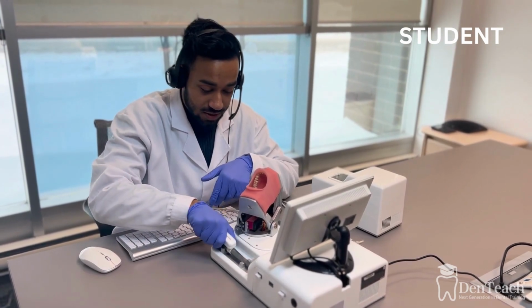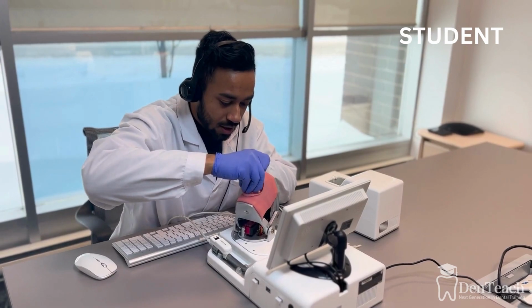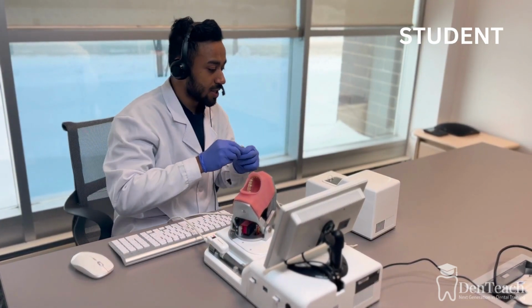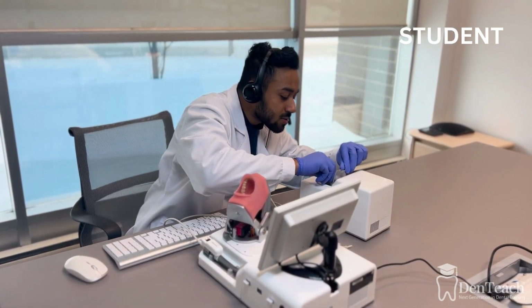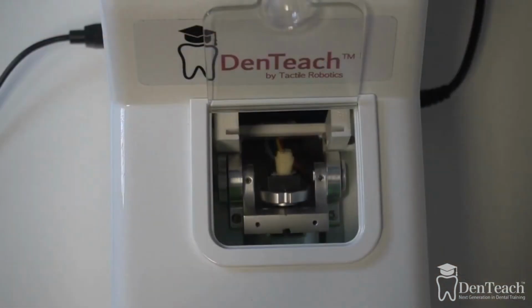Once the student has successfully completed their prep and feels that they have done a good job, students can now insert their tooth into our DT Prep scanner, which allows students to scan the surfaces of their tooth and take precise measurements within 20 microns.